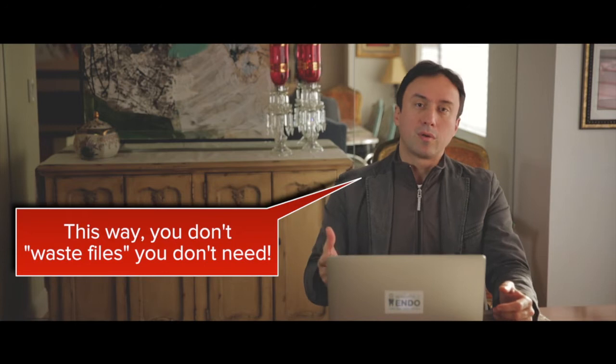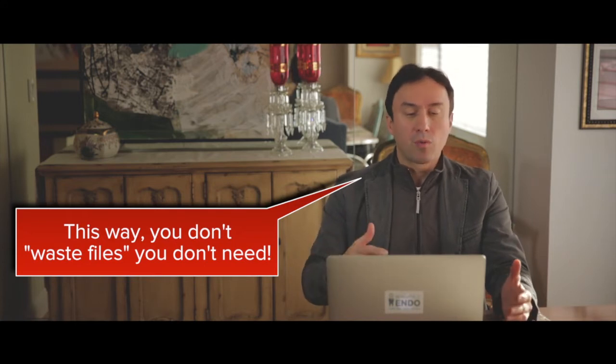But you might say, Ali, this is great and I can do a lot of cases like this. Once I get a 15/02 down, I can finish most of the cases with 2 files. However, when I'm doing molars, oftentimes this is not really possible, and I agree. That's really the beauty of the ESX system, that it's modular. You end up only using the minimum number of files required for a given case, whereas most systems give you too many files so that you could do more cases. ESX starts with a minimum number and then you build on those based on the requirements of the case, and the requirements are always determined with a size 15/02 hand file.